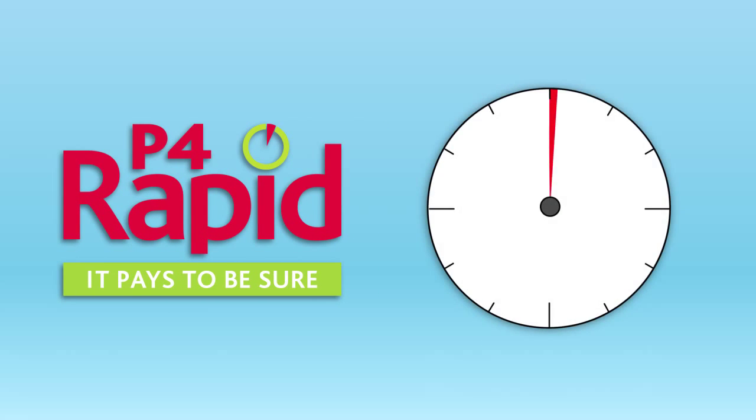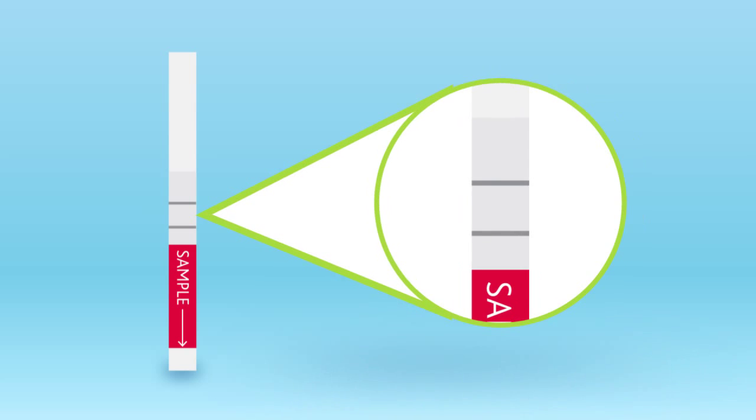And all it takes is 5 minutes in the parlour. Once you've run the test, you can see the results on the dipstick. Two strong lines mean your cow is in heat and OK to AI.